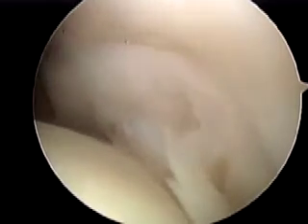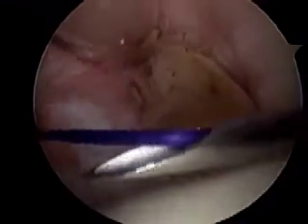So then when we looked at the articular part of the lesion, we saw the lesion, and then we decided to mark it with a Prolene suture passing through a spinal needle. And after that, we went to the subacromial space. So now we are working from the lateral portal, watching from the posterior portal, removing all the bursitis and the synovitis until we found the acromion.